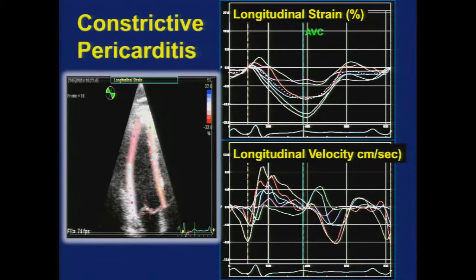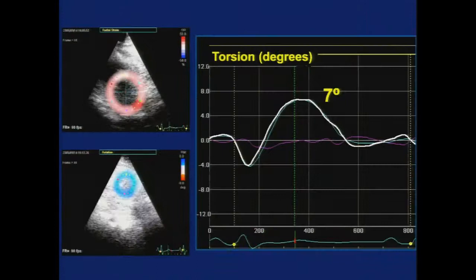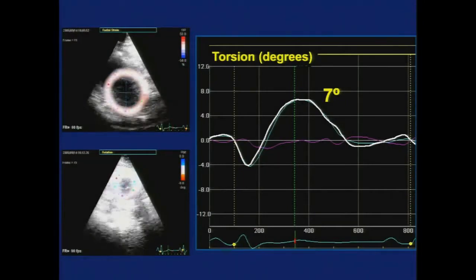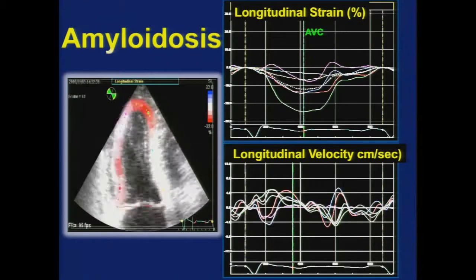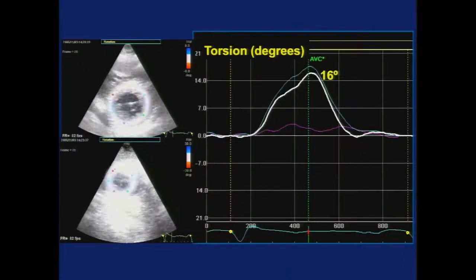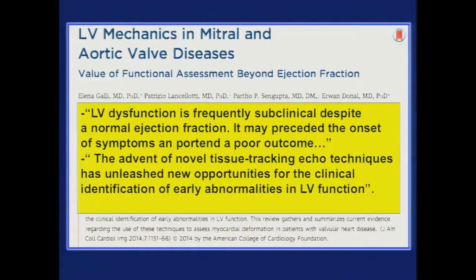For example, here's a patient with constrictive pericarditis. Well, constrictive pericarditis is a problem of the pericardium. The pericardium is adjacent, of course, to the epicardial fibers of the heart. Longitudinal function, which is influenced by the endocardial fibers, in constriction tends to be augmented. And in constriction, rotational dynamics tend to be depressed. Perhaps there's inflammation because of the adjacent inflammatory component of the pericardial disease. Contrast this to a patient with amyloid, where you see the opposite, where there's a reduction in longitudinal and more augmentation of rotational dynamics. So it's really this concept of pattern recognition.